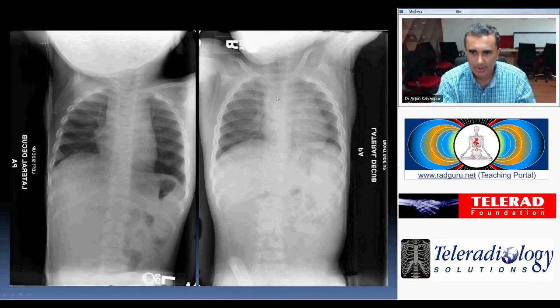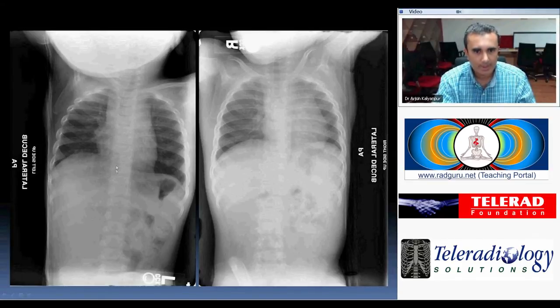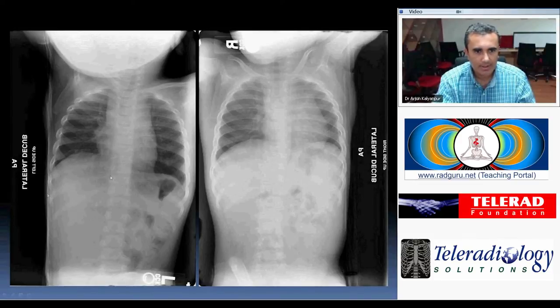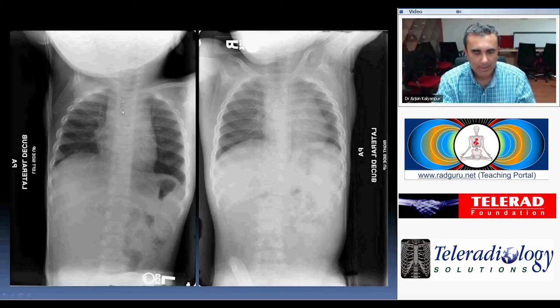However, if we look at the other decubitus — which is the right side down decubitus — we notice that this doesn't happen. The mediastinal structures have not moved over to the right, even though the patient is lying right side down. We would expect that under the weight of gravity, the mediastinal structures would become more dependent and the right lung would decompress. The fact that this does not happen indicates there is some sort of ball valve mechanism within the right main stem bronchus which is preventing the right lung from decompressing.